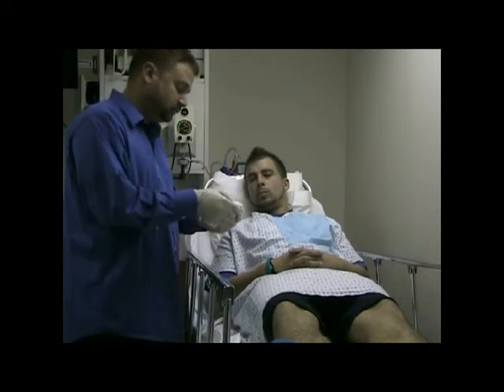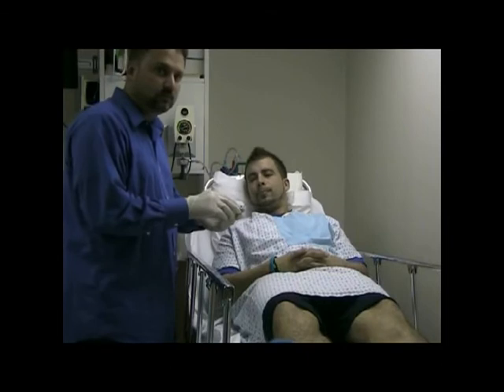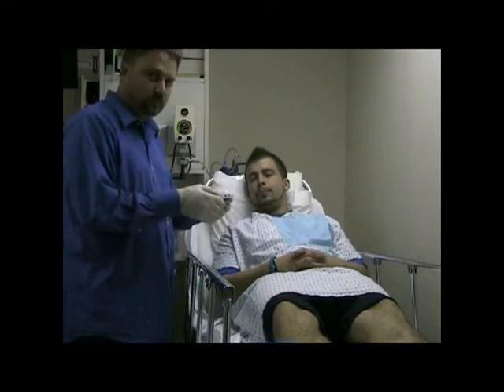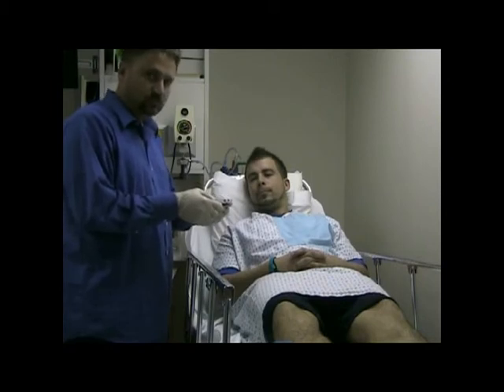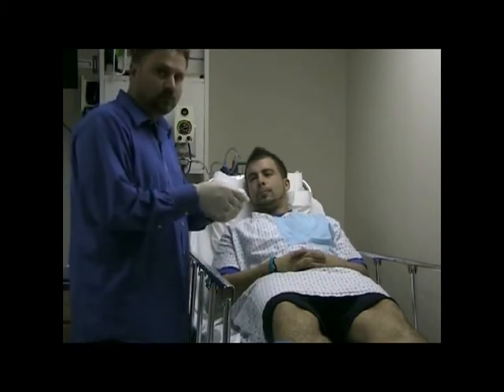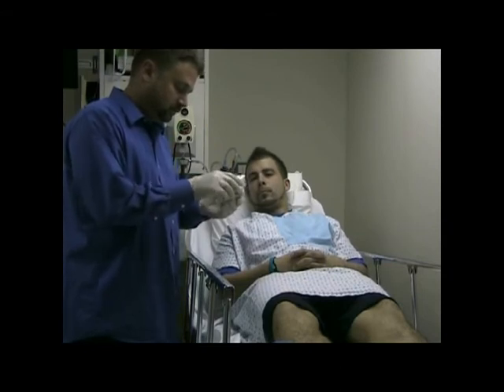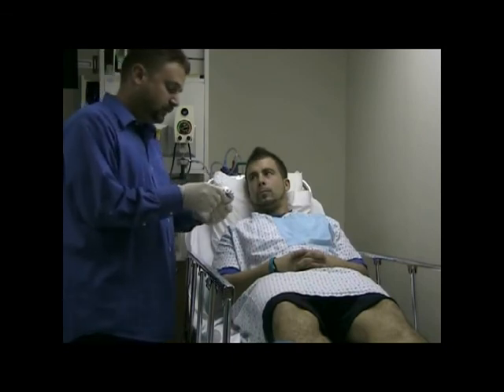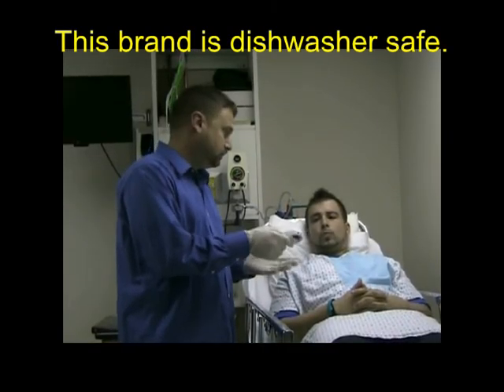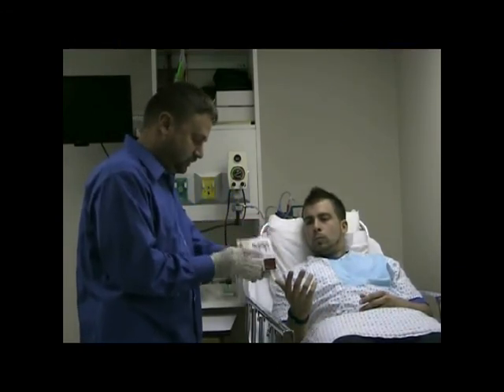I've set your yellow zone to 275 to 440. Below the 275 into the red zone will indicate the patient should see the physician or go to the emergency room. Your red zone is set at 275 — if you don't meet that peak flow, you go to the emergency room. This unit at home you can run in your dishwasher for care and maintenance. You can keep that in the box with you.